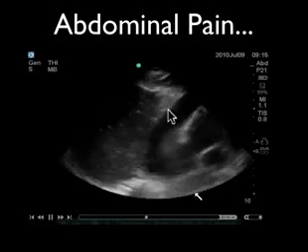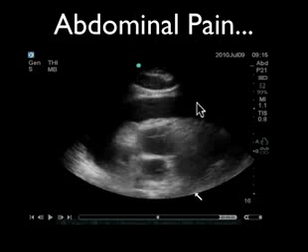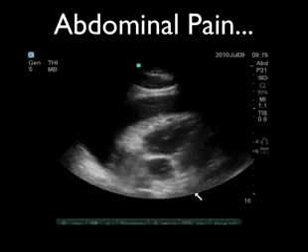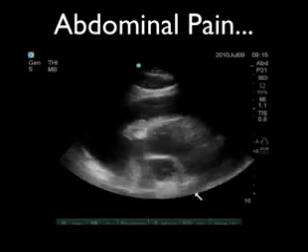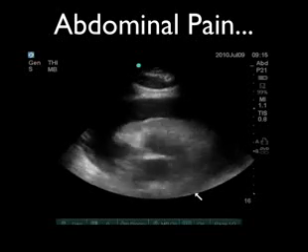This patient has quite a large pericardial effusion there, and actually ended up needing to go to the cath lab to get a pericardiocentesis. We can see there's 2 to 3 centimeters here of fluid between the anterior pericardium and the myocardium, and this was a big-time incidentaloma, an incidental finding where we were looking for gallstones.